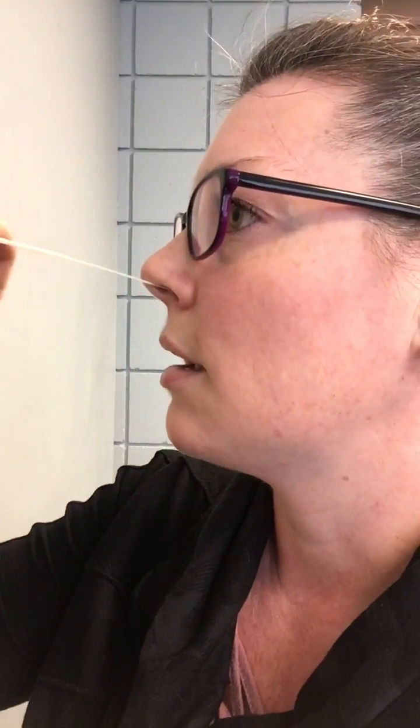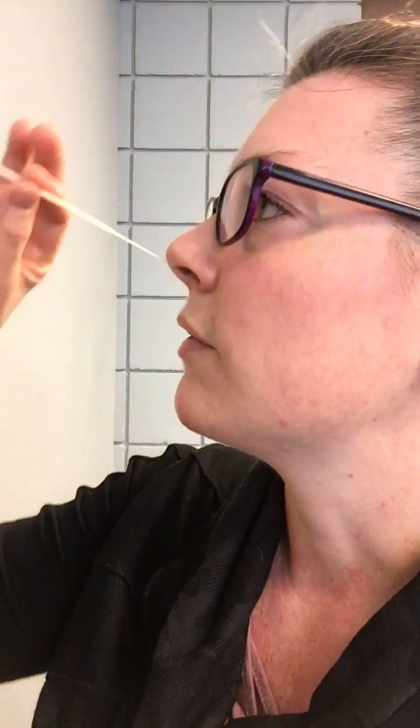Now if you're going in and find you can't get in — about one inch in and it's causing lots of pain, you see their hands go up — that means pain. If they've ever had a really bad swab, it's extremely painful, and there's a good chance they have a bit of a deviated septum. The septum is extremely sensitive, so if you can't get in, take it out, go right to the other nostril, and there's a very good chance you'll be able to go straight in that way. And that's it — any questions, just message me down below.